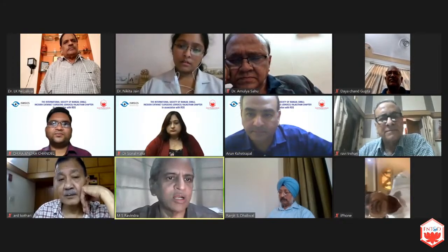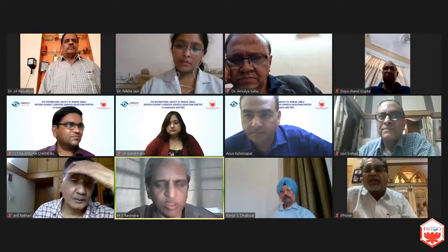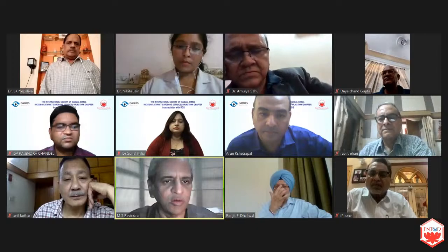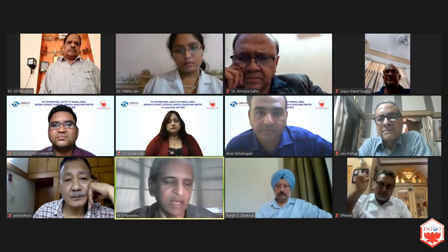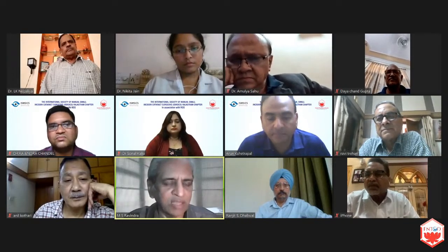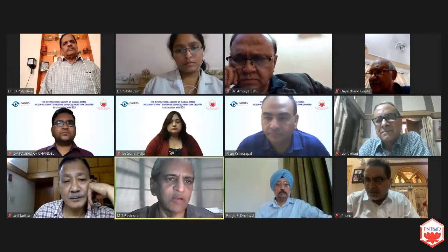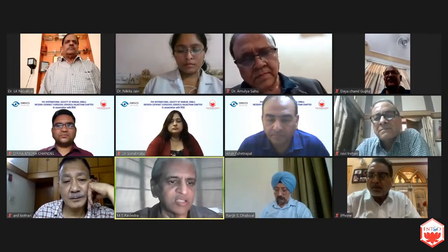Okay. And go by the A constant. Postgraduates should always analyze what they're doing. Everything you have to keep in record: your K reading, pre and post op. And what is your target? What is the A constant? What did you achieve? If you make your own study, you will get much better information, not only about the target emmetropia that you're planning for, but also the astigmatism you're going to target. So this is for every case. When you are maintaining a register, record the curvature of the cornea before and afterwards. Many people say postoperative, I want half diopter astigmatism. Half diopter of astigmatism at 180, and the patient had half diopter of astigmatism at 90, it is not zero. It is one diopter of SIA. Similarly, if the target emmetropia you're planning to achieve is zero, and you have achieved half diopter, you should not keep quiet. Go and find out why you have erred on the half diopter side. There may be 100 reasons. Unless you have this discipline of documenting what results you have, you will not improve scientifically.